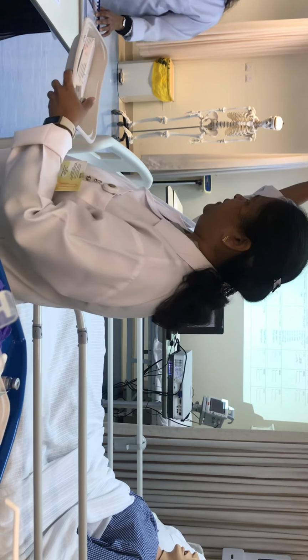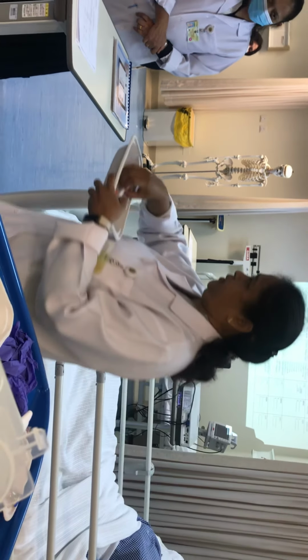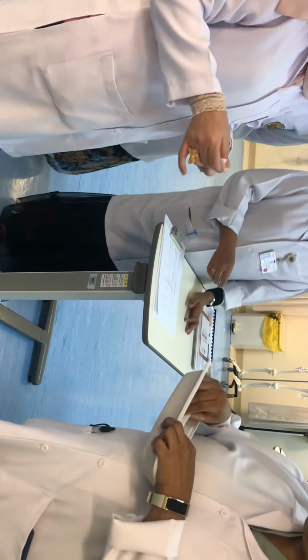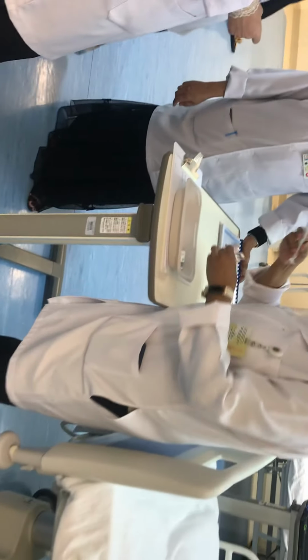I'm taking the other syringe also so that I can show along with that. That's why I'm taking 2 syringes. These are the syringes. We have 100. In between there was 50 also coming. 100 units. Why is this designed as 100? You can explain it to the students.